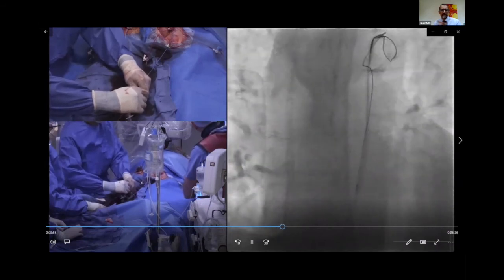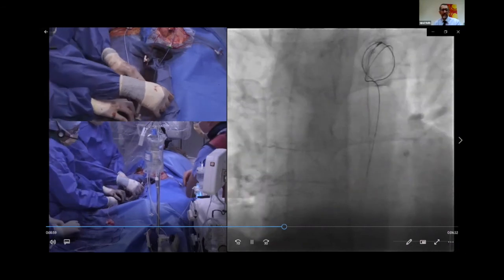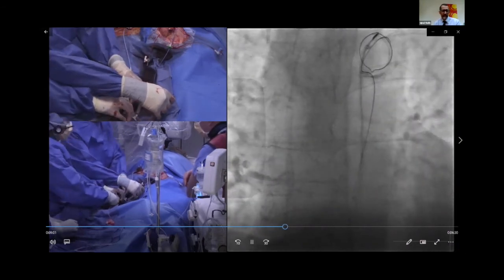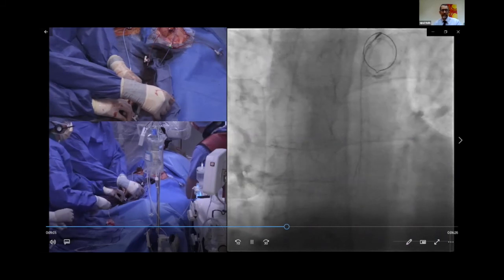So just to go back to where we've got with this technology now in the case, we had to balloon with a 3 or 4 millimeter angioplasty balloon, because nothing would actually cross the aorta, even the Navi Cross wouldn't go.